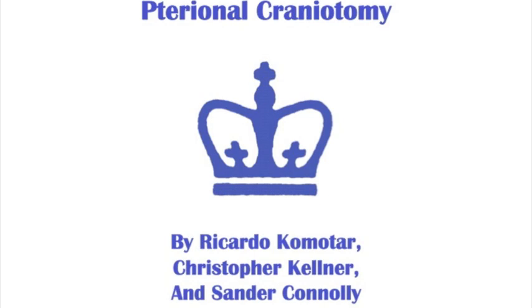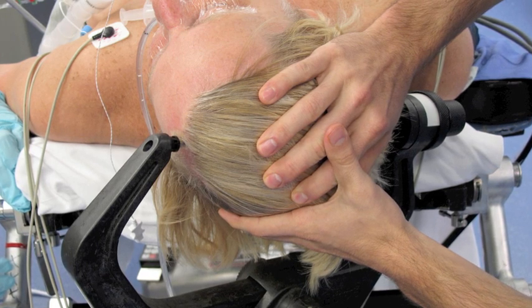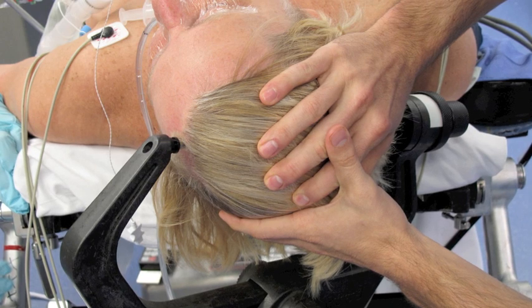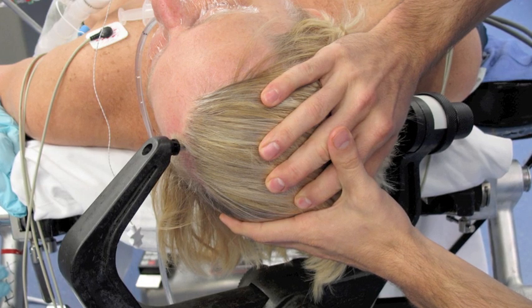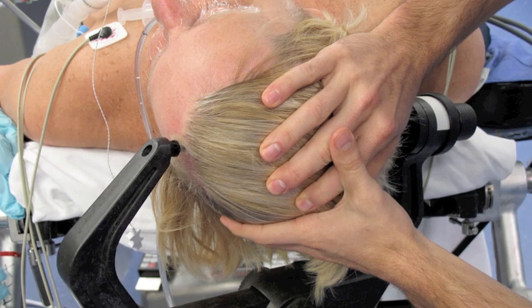This is Ricardo Komotar and Christopher Kellner in conjunction with Sander Connolly leading you through a pterional craniotomy. The patient is positioned supine with their head turned, slightly extended, and elevated. Cranial fixation is obtained via a Mayfield clamp with two pins placed low on the occipital bone and one just contralateral near widow's peak.